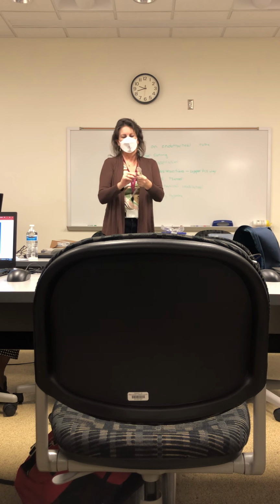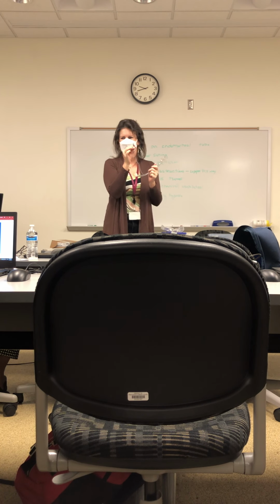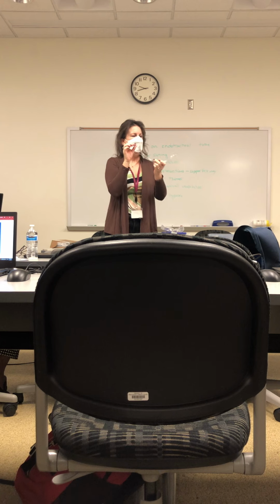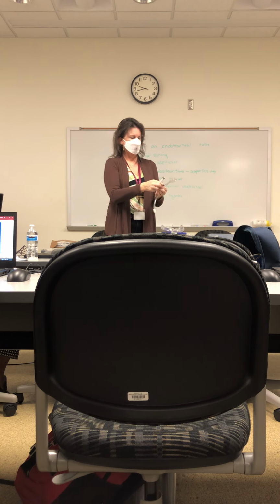I want you to feel the pilot balloon when you have it inflated well, because you're going to get used to how this feels, whether it's inflated enough or not. So this is holding air. I can add more air to it. This is holding air so I don't have a leak. So my tube is good to use.